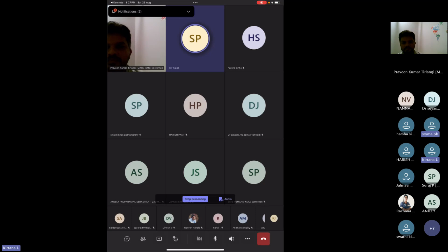So some people just see very high tidal volumes and think you can reduce pressure support. That is a very big fallacy. If you are seeing high tidal volumes on NIV, that means the patient is going to fail NIV.